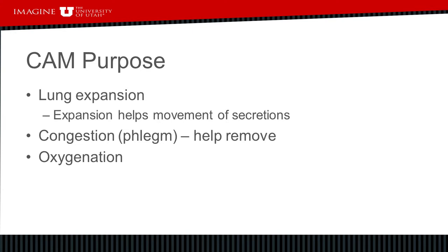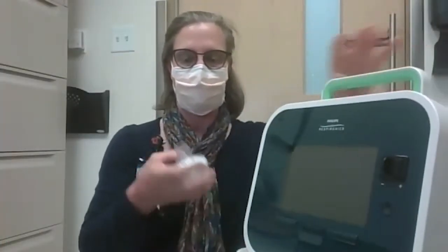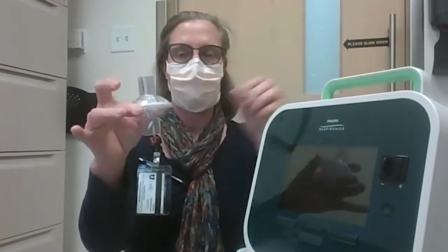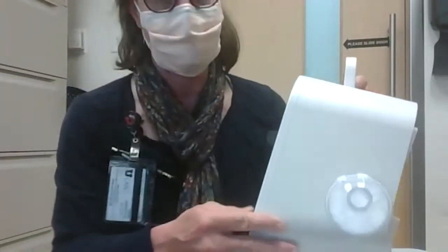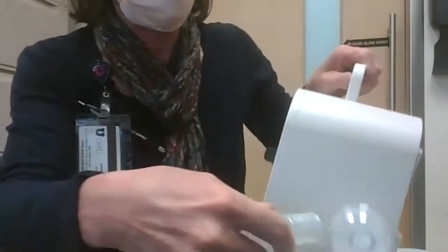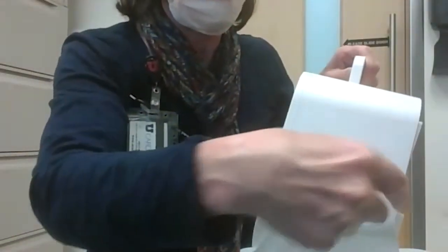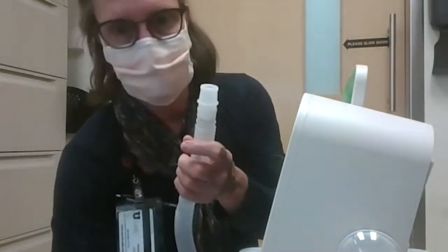The cough assist machine has a filter that gets placed on the side of the machine, and then the tubing, and from there there is an adapter that connects to the cushioned mask.